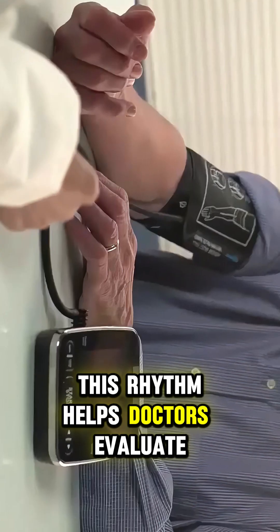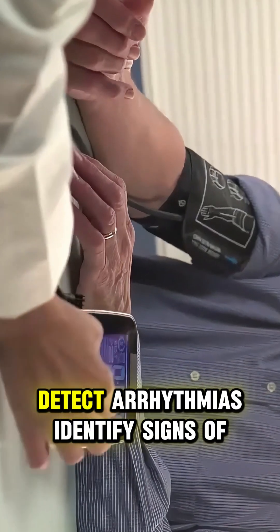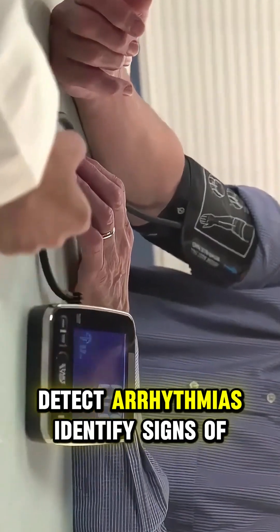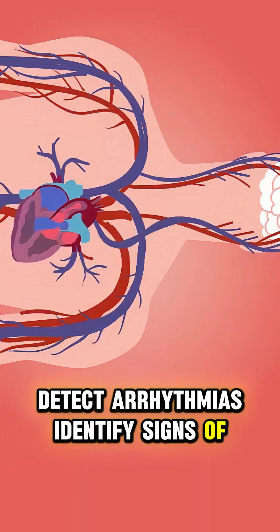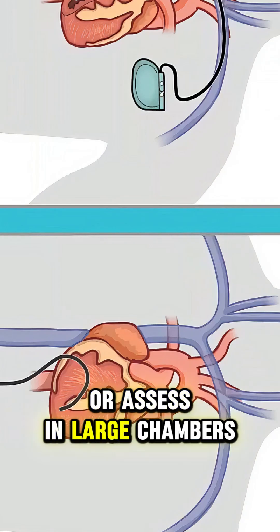This rhythm helps doctors evaluate heart rate, detect arrhythmias, identify signs of heart attack, or assess enlarged chambers.